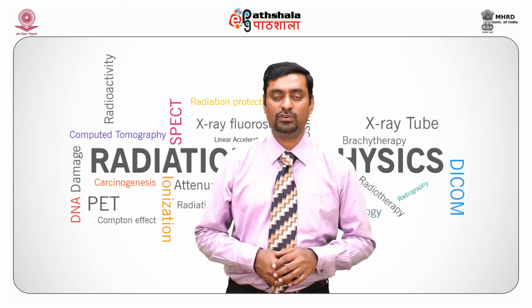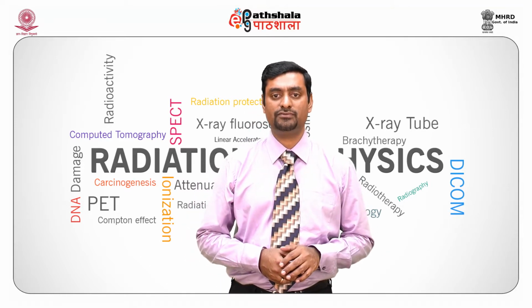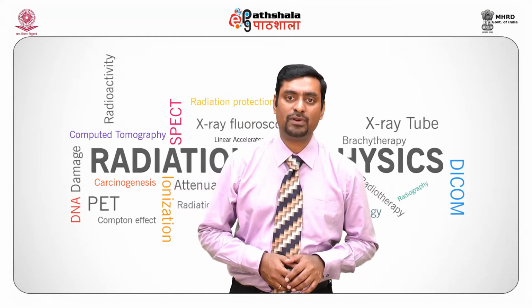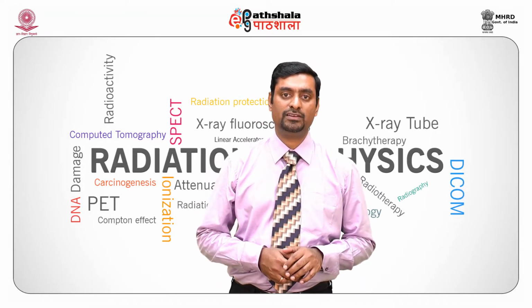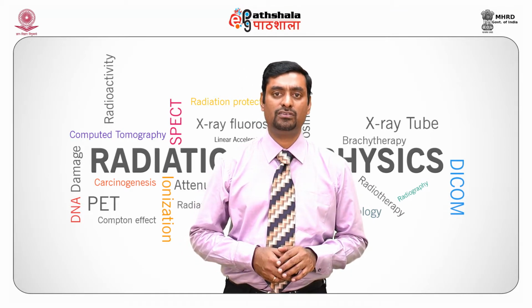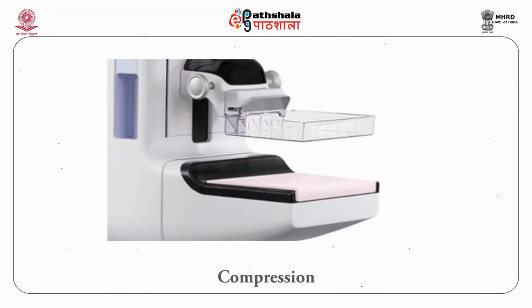There is also a high voltage generator. A near DC high voltage waveform with minimal ripple can be used. The tube voltage should be accurate to about plus or minus 1 kilovolt. The tube current should be about 100 mA or greater on large focus and 50 mA or greater on fine focus. There is also a compression device.